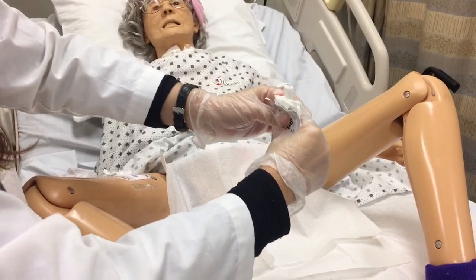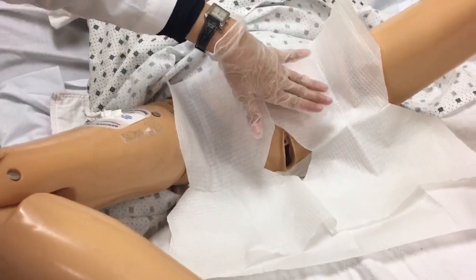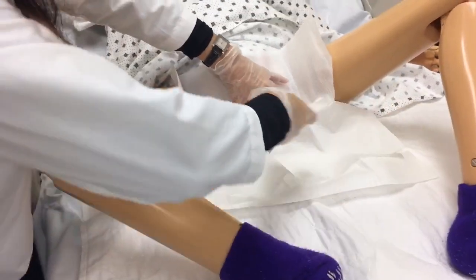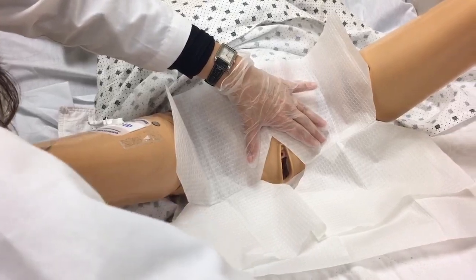Cleanse by wiping the far labial fold, the near labial fold, and directly over the center of the urethral meatus. Appropriately dispose the used cotton balls or swabs without contaminating the sterile field.